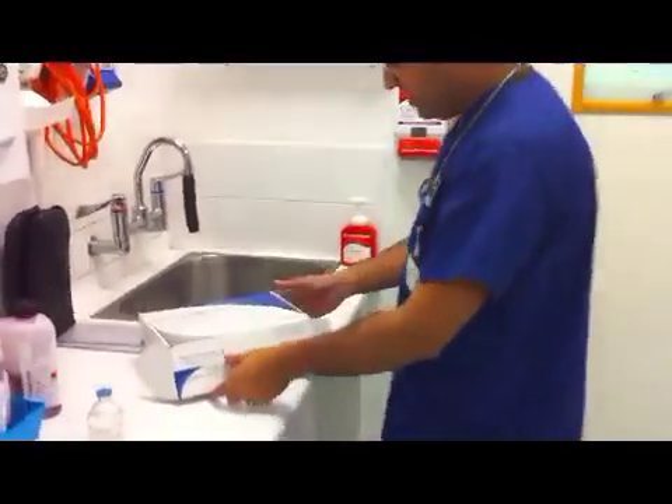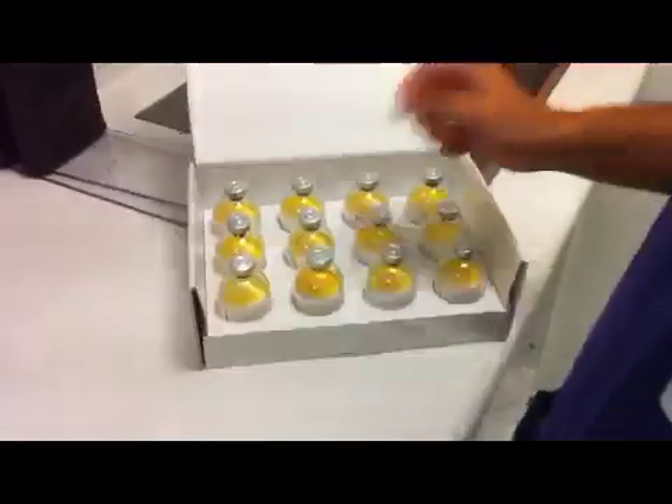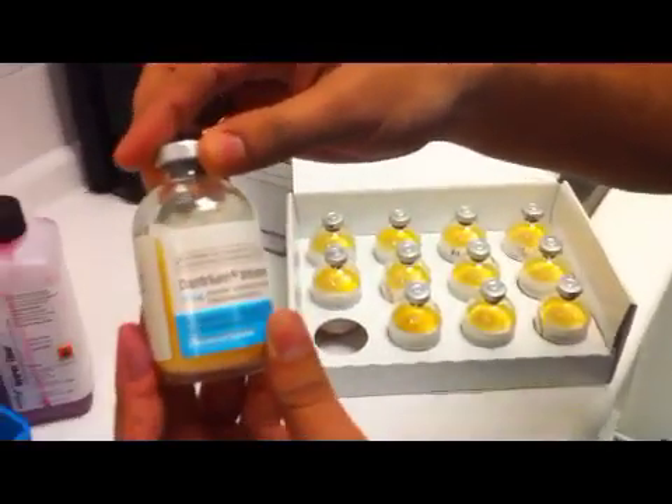This video demonstrates the preparation of dantrolene. Dr. Ram Doteca will prepare the dantrolene in real time to provide an accurate representation of the speed of reconstitution.